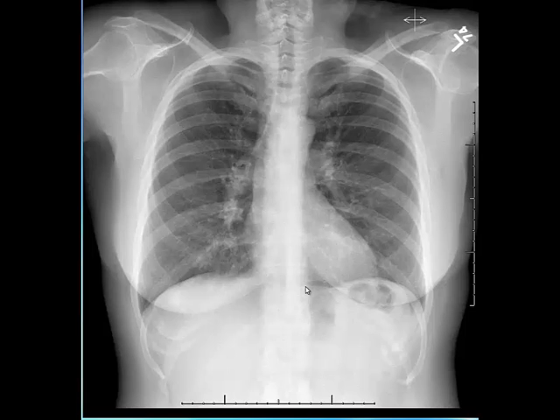The last thing I evaluate in the technique is to assess for respiratory motion. I look at the diaphragms and try to see if there are sharp edges of the diaphragm and also of the osseous structures, to confirm sharp edges indicating lack of respiratory motion.